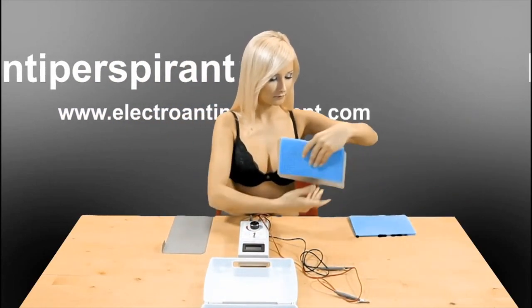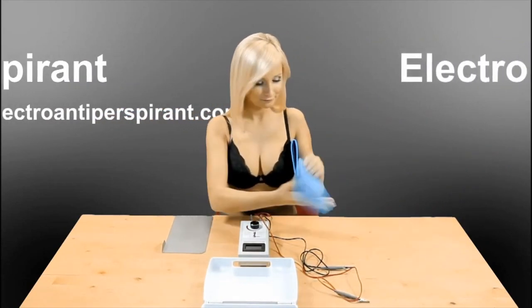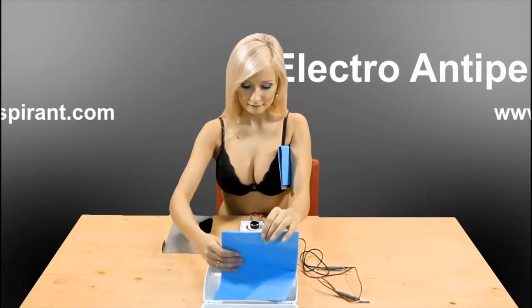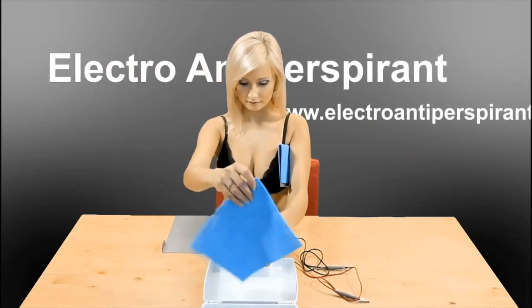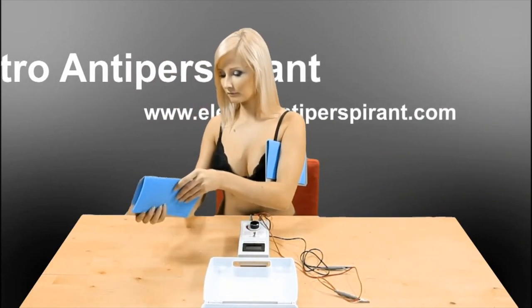Once the electrodes are in the armpits, make sure that Electro Antiperspirant and the green LED are off, then connect the wires to the electrode and carry out the therapy as described in the instructions for use. Turn the power controller very slowly. Do not switch positions 1 and 2 while the device is on. Remove the electrodes from the armpit only after the device is completely off.